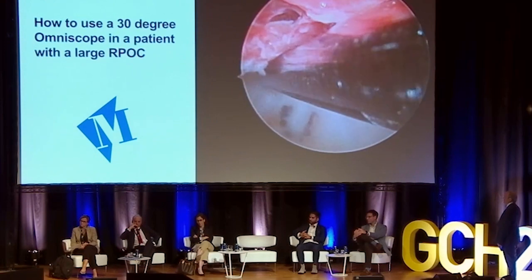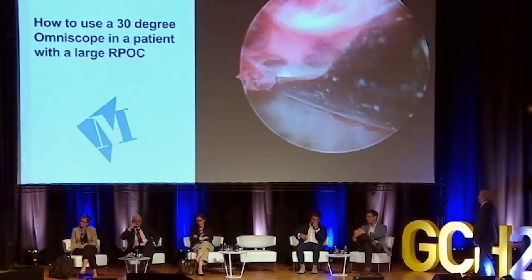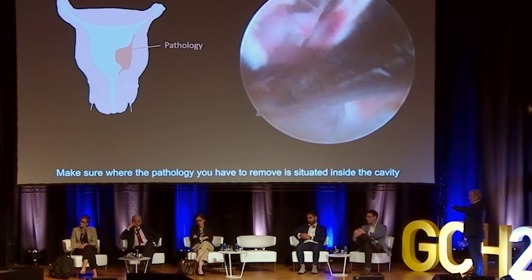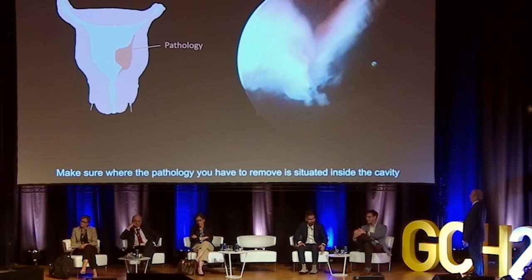If you work with 30-degree scopes and you are familiar with doing it with 0 degrees, it might be a little bit challenging. So this video shows you some tricks you can use when you're using a 30-degree scope. And one of the most important things is that you have to make sure where your pathology is situated.